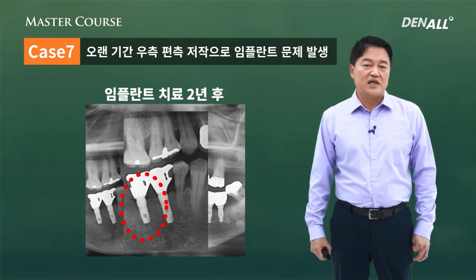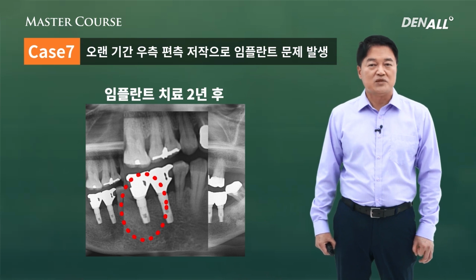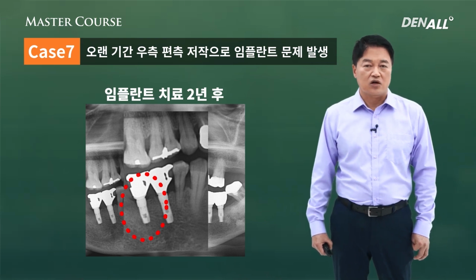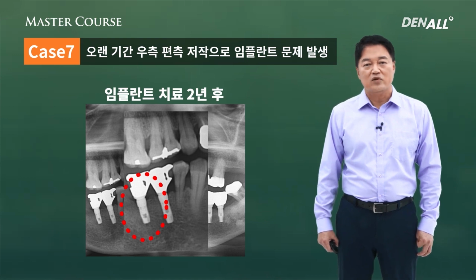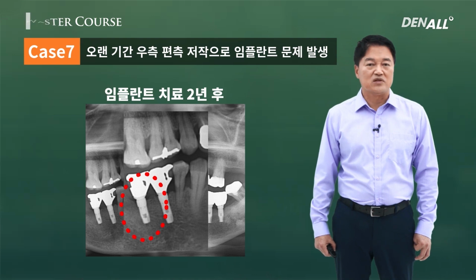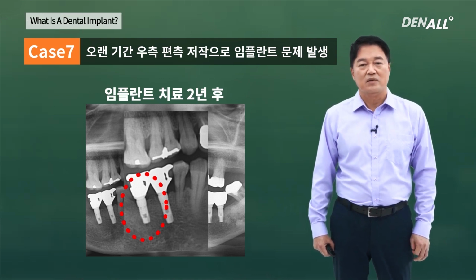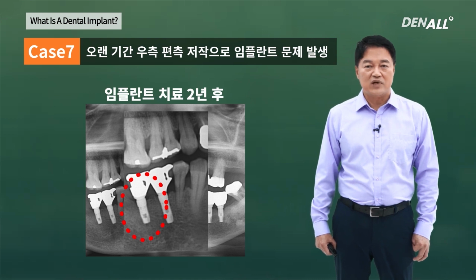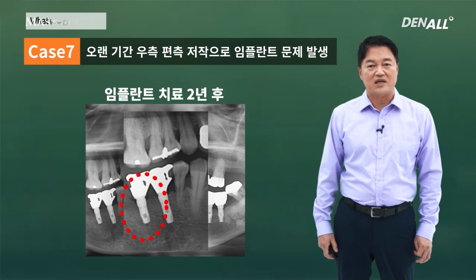Most dental disease is caused by overloading, and it's obvious to experienced clinicians. It's especially so for periodontal diseases. If you do implant treatment, overload is not applied and force is dispersed, so the remaining teeth can be used in a sound manner for a long time. In missing areas, implant treatment is the optimum option.